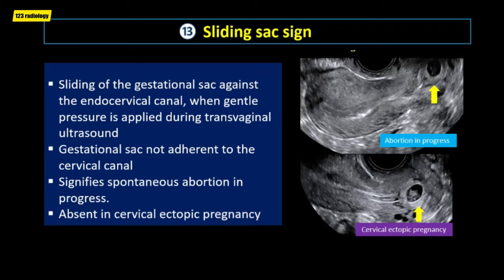In the banana sign, the cerebellum curves around the midbrain, giving the appearance of a banana shape. This sign is seen on axial images through the posterior fossa of the fetus. It is associated with conditions such as Chiari 2 malformation and is also seen in the majority of fetuses with spina bifida.